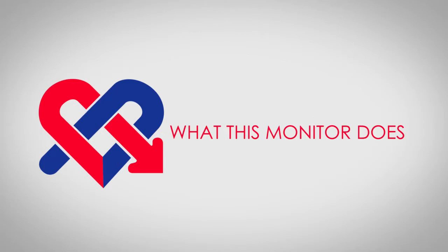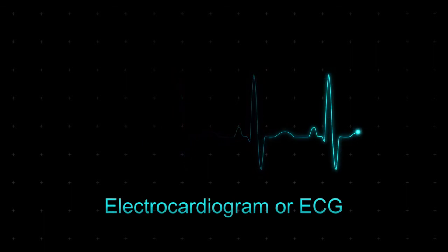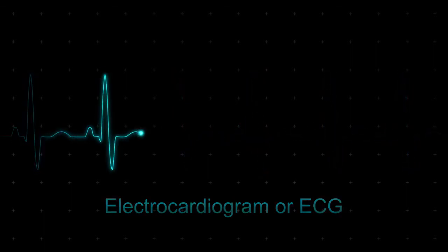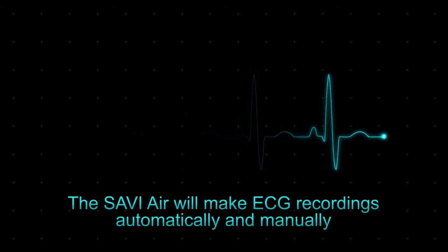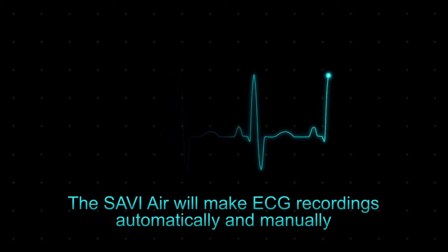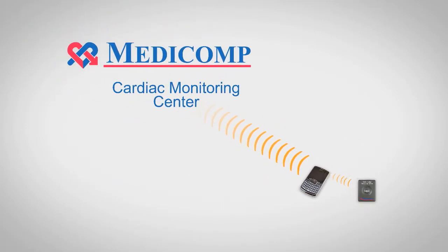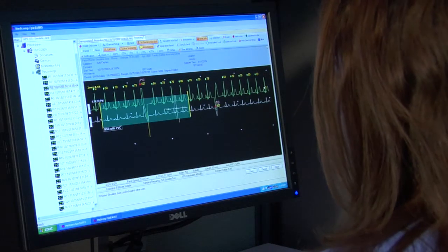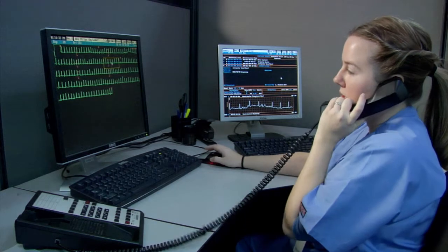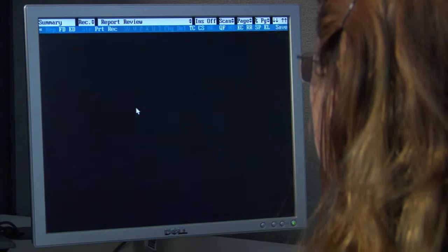What this monitor does. Savvy Air will allow you to record your own electrocardiogram, commonly known as an ECG, when you feel a symptom. The monitor will also make an ECG recording on its own, automatically, without your interaction, whenever it detects a possible arrhythmia, even when you don't feel a symptom. Your ECG recordings will be sent wirelessly via the cellular network to one of Medicomp's 24-hour cardiac monitoring centers. Our team of cardiac specialists is on hand 24 hours a day, 7 days a week to receive and review your ECG data, and then compile detailed reports for your doctor.